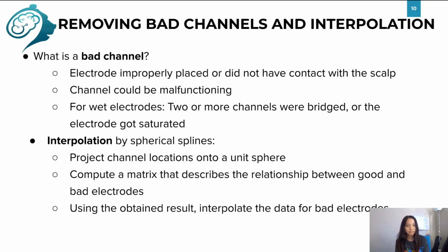them from analysis. So it takes experience to determine how much noise is appropriate, and using techniques such as independent components analysis, or ICA, can remove some of the noise without having to resort to removing an entire channel. Again, if you have a lot of bad channels, or if you don't have many channels to begin with, simply removing bad channels will result in a significant loss of information. So in that case, you might want to repair or interpolate the excluded channels instead.